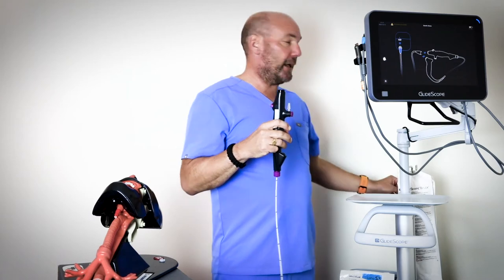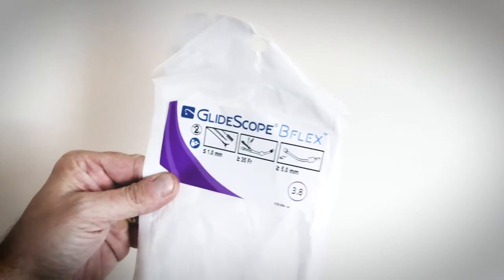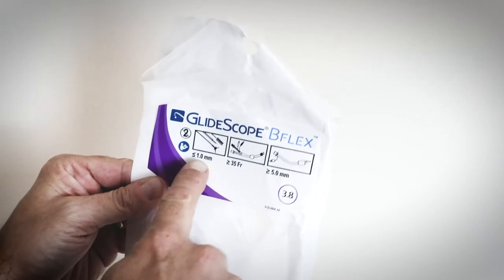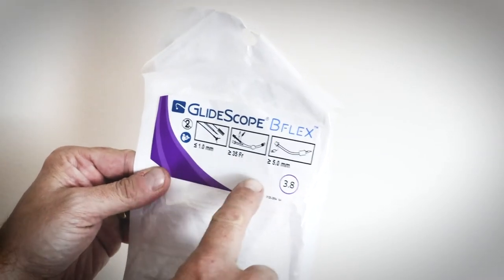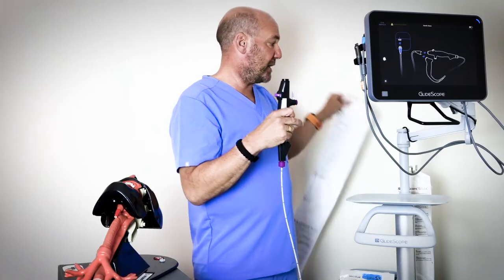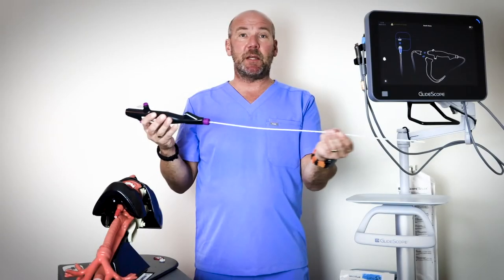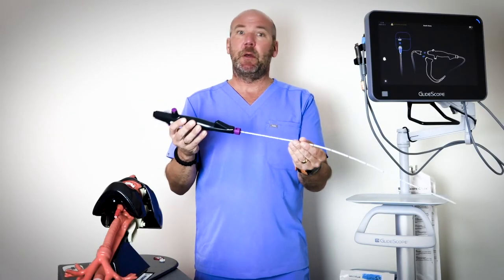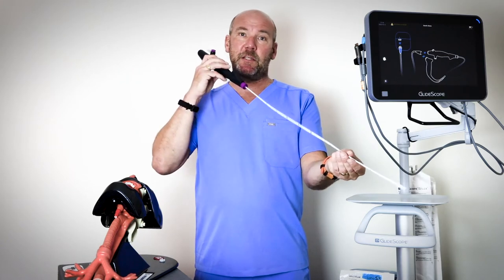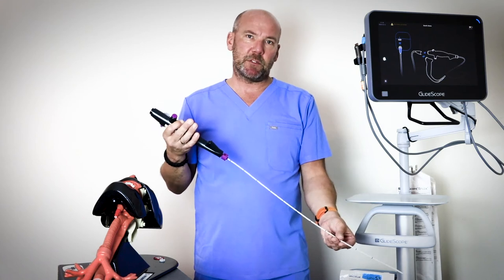One thing I really like about our packaging is that we give you that information actually on the pouch — we don't just give information about the scope, we tell you what tools you can use, what size French double lumen tubes and what size ET tubes. We don't expect clinicians to always remember the specs, and the scopes are nice and rigid; we reinforce them to make them that way so they're easier to drive and deliver into the airways, and the feedback we've had is that they're really responsive.